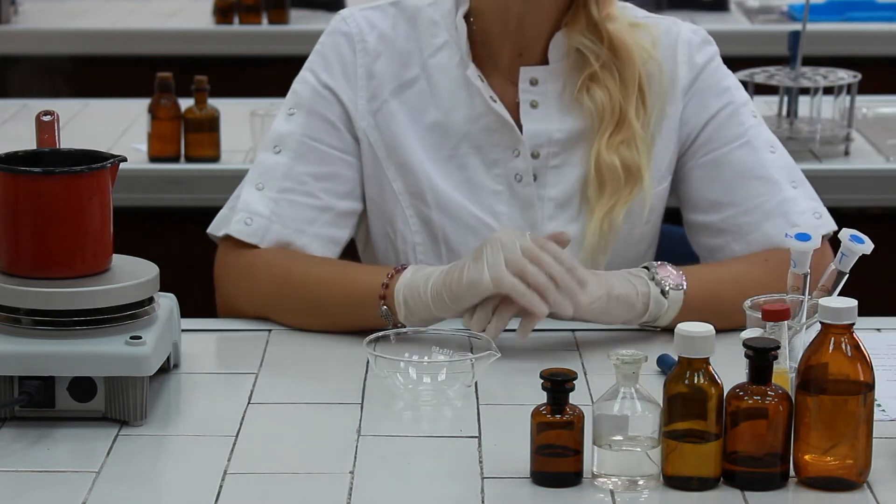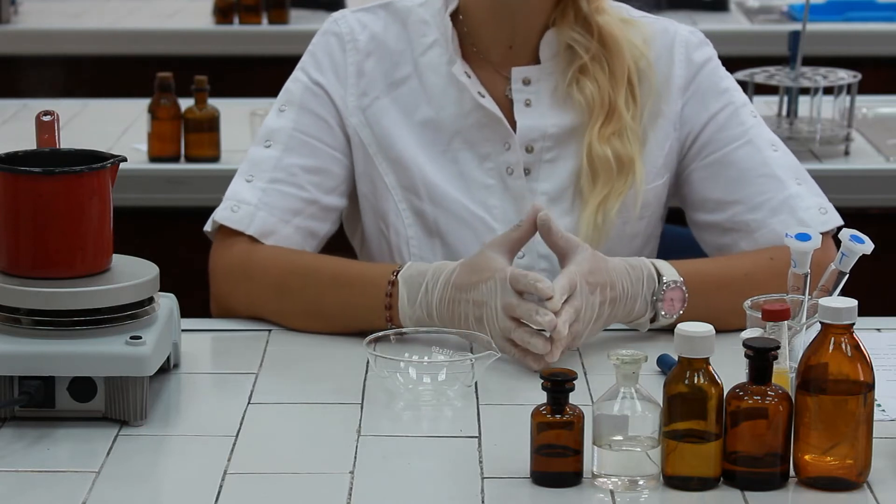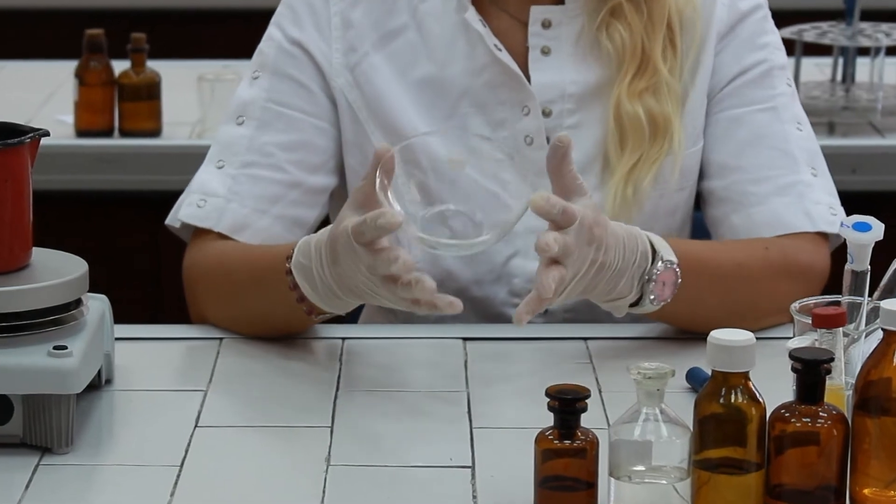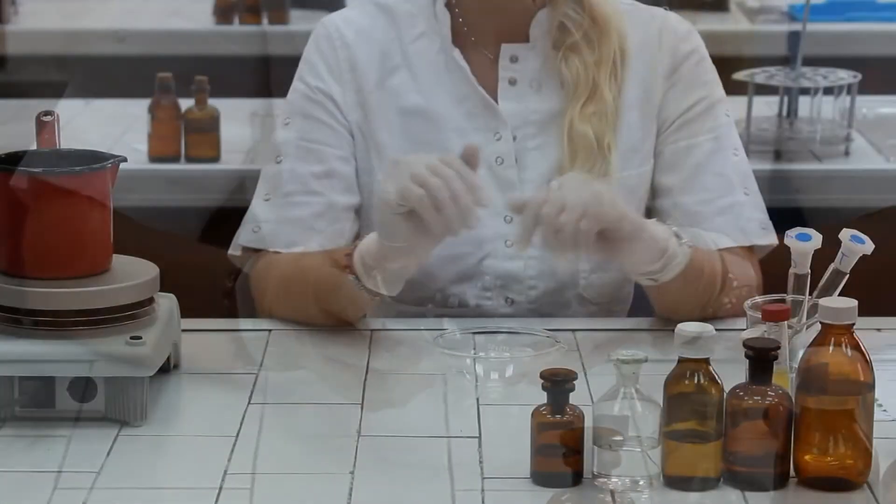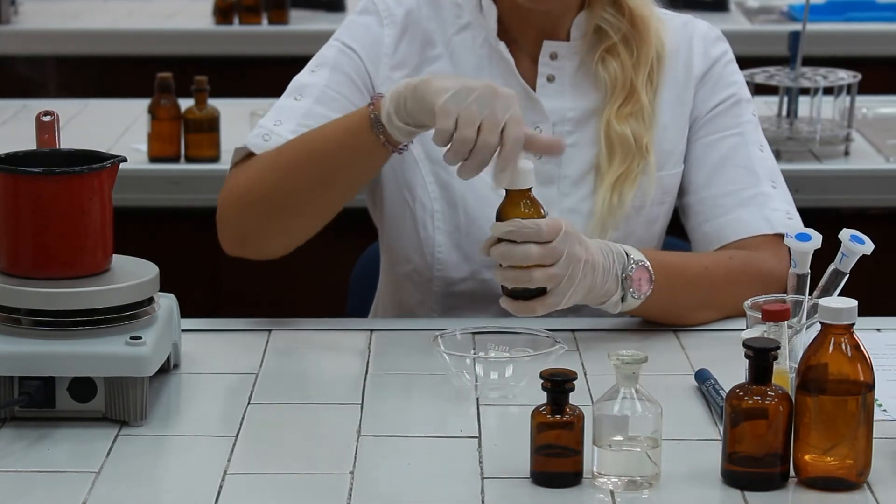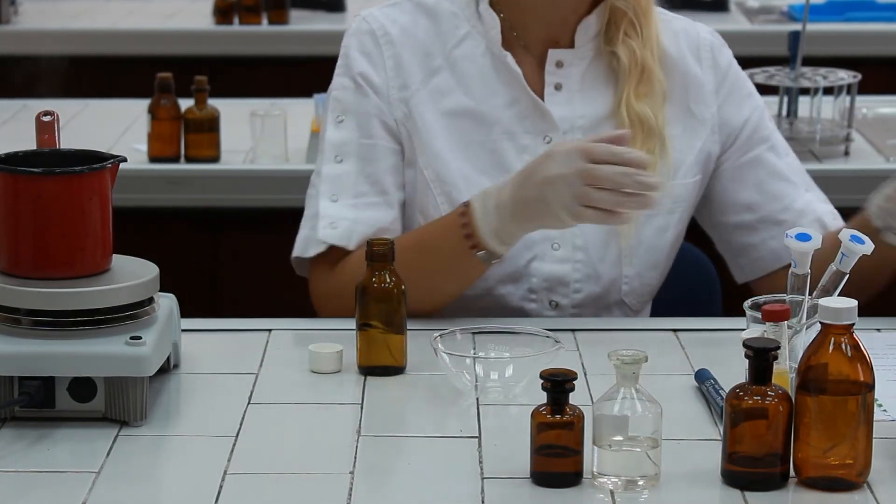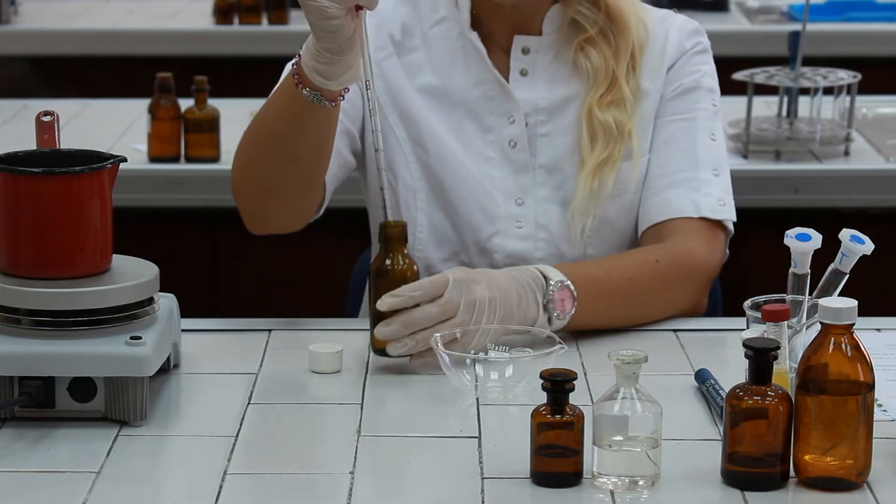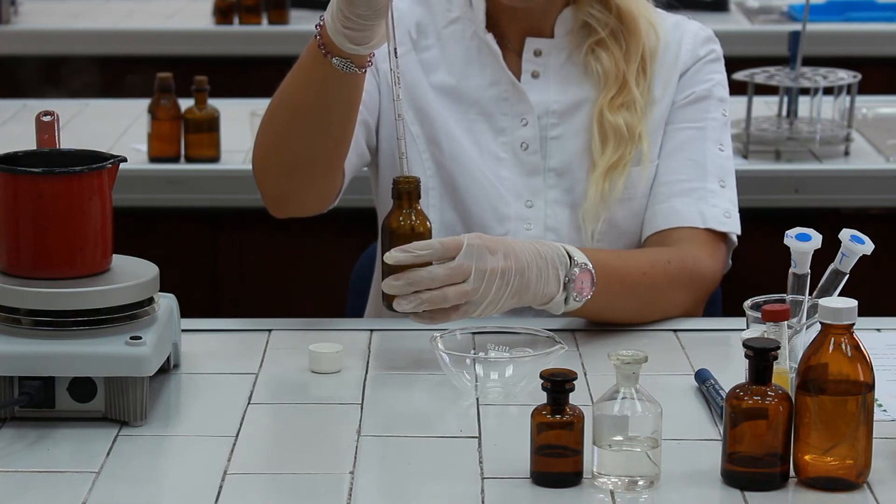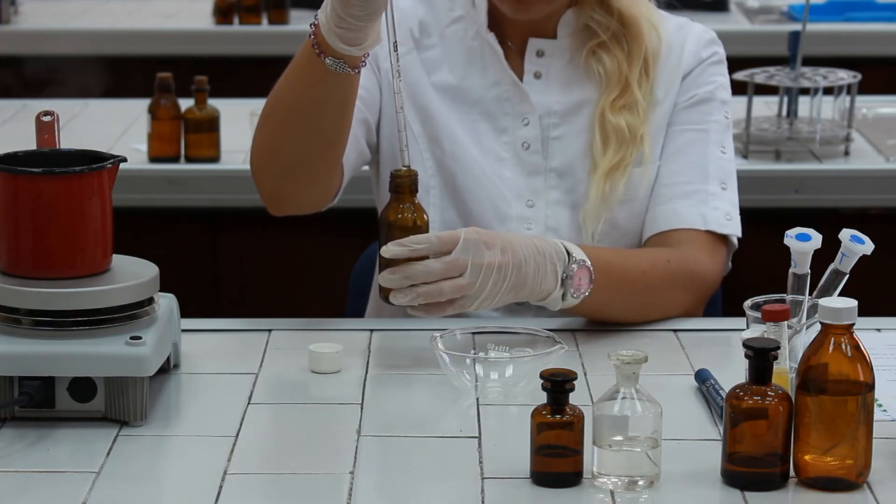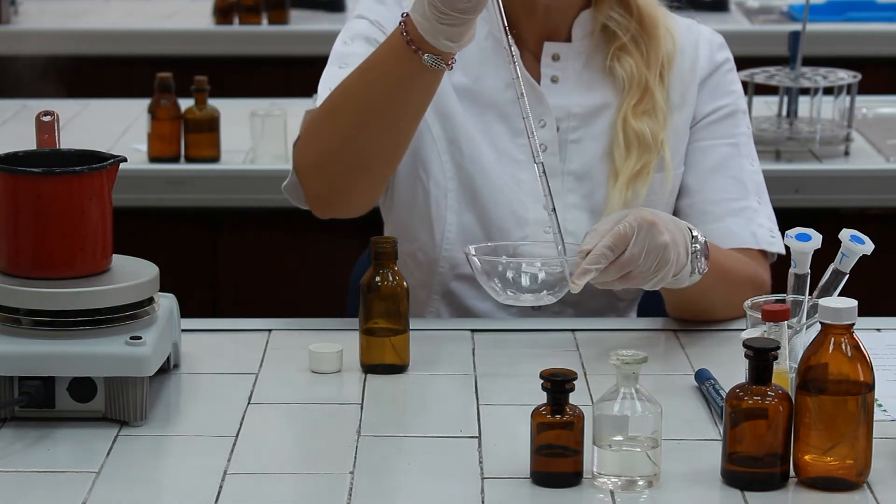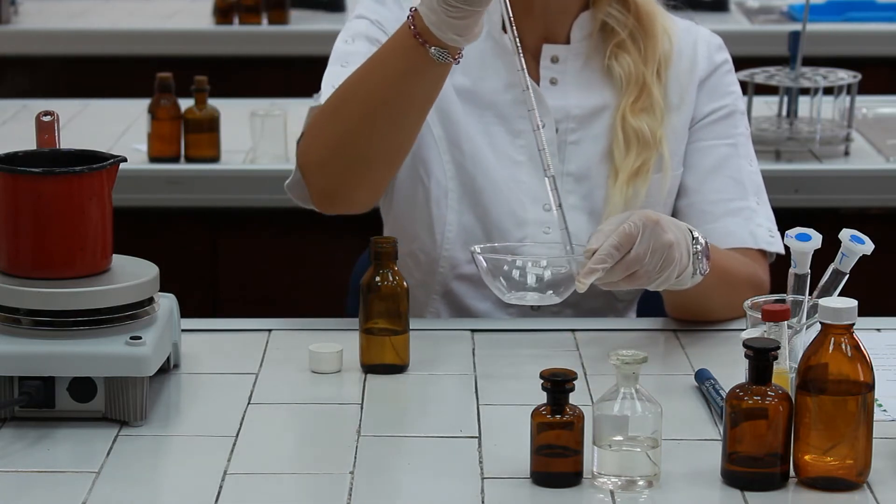The next step in procedure is to prepare the chloroform solution of the extracted cholesterol which is concentrated here in evaporating dish. In order to do this we are going to pipette three milliliters of chloroform into the dish by rinsing the walls of the dish at the same time.